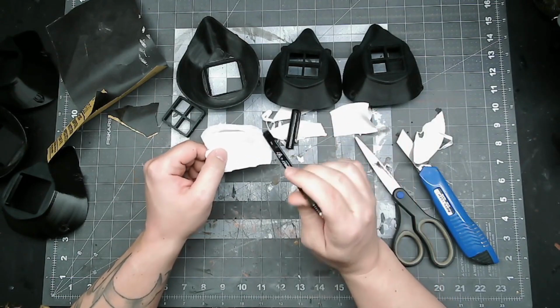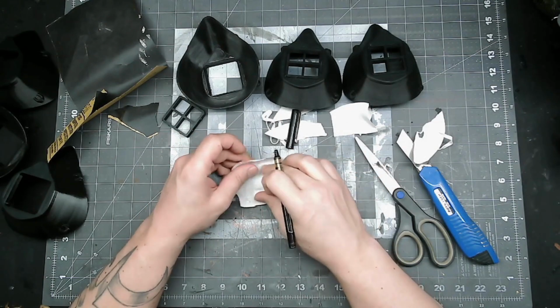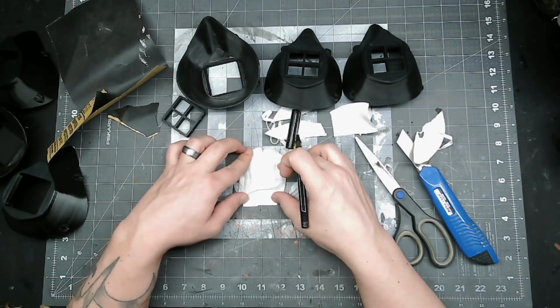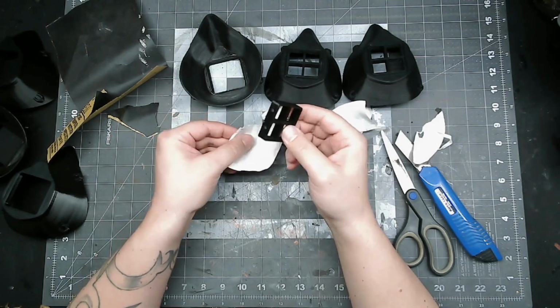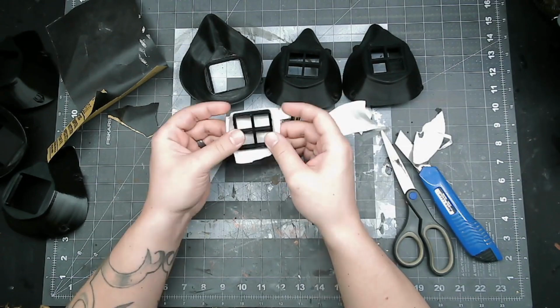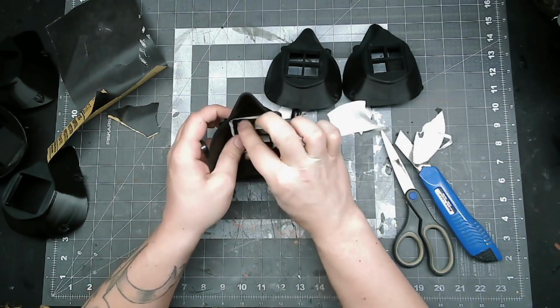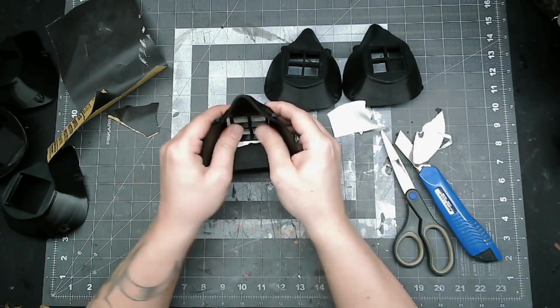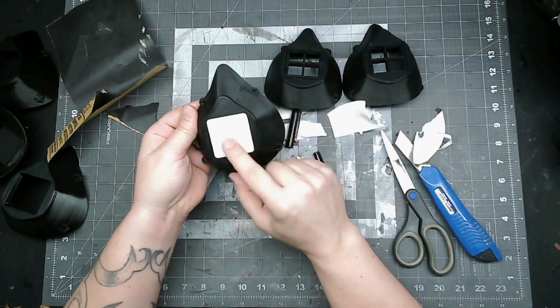So what you're going to do is cut your N95 masks into 6 2.5 inch squares. So it's just going to be 2.5 by 2.5 in all directions. Then you take your N95 piece and you put it on the outside, whichever you've deemed to be the outside of your insert piece here, and then you push it into the mask from the inside, and it'll pop right in place and just stay there from tension. Now you have a filter.